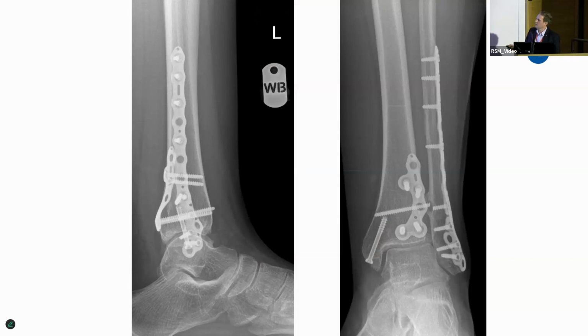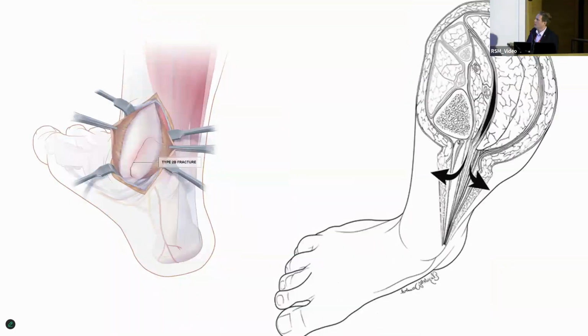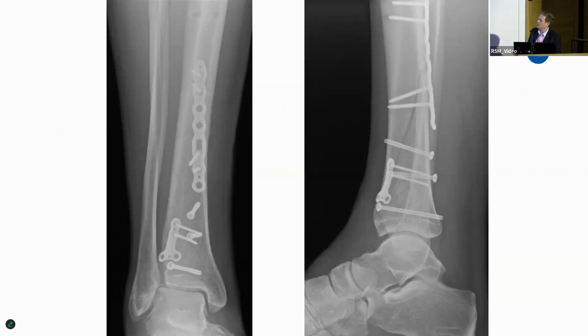But can you see here? This has been over-reduced, so much so that it's actually even impinging on the fibula. So when someone says, can you get to the lateral aspect of your tibia? You can actually go even further if needs be. So it is very easy to do. Also, it's on your fasciotomy line, so you can unzip it all the way to the top. So you're doing a case like this, just in a supine position, where you can get to the front of the tibia. It's from a few years ago.